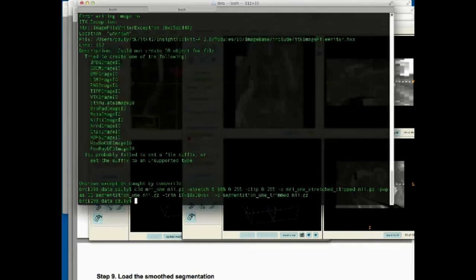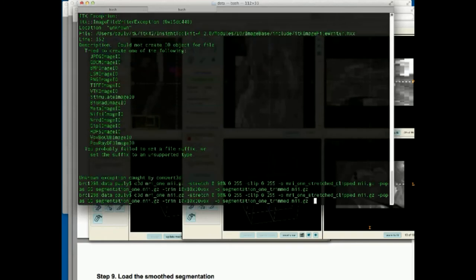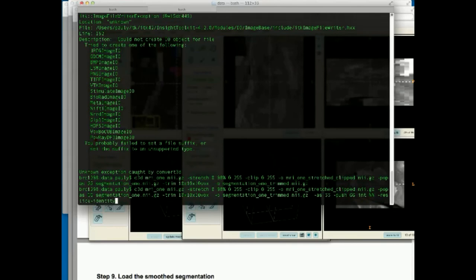That's fine. Let's just go through the command pretending it all works. It does. I mean, there's some typo probably somewhere. Okay, so now the trimmed. We went through to the reslice identity. We pushed the gray image, and then I'm just going to type NN. That's another example of a shortcut. Instead of nearest neighbor, reslice identity, I'm going to skip the -O. Now push back the trimmed segmentation one more time.